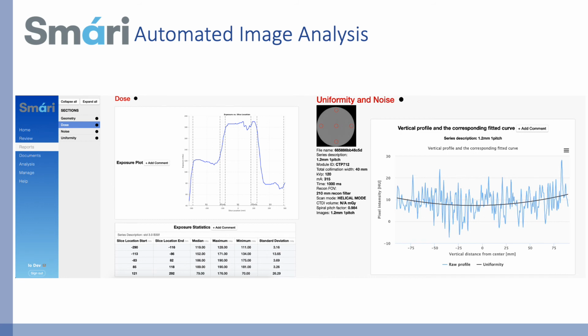Just as the analysis of the MR phantom is critical in evaluating performance, TG233 notes the importance of assessing image quality using metrics that are more relevant to predicting the performance of a CT system and protocols for clinical imaging tasks. It further states that, quote, "mathematical observer models are a powerful alternative to human observers for CT performance evaluation."